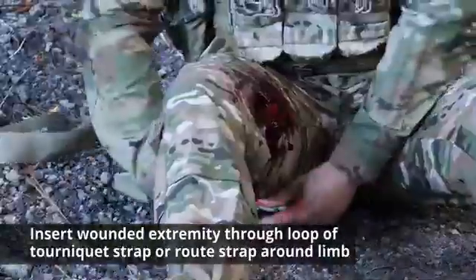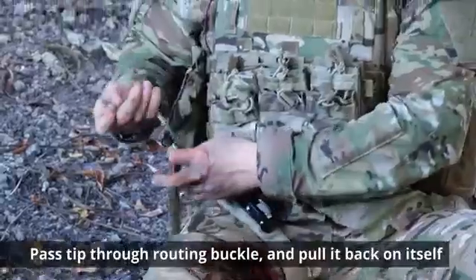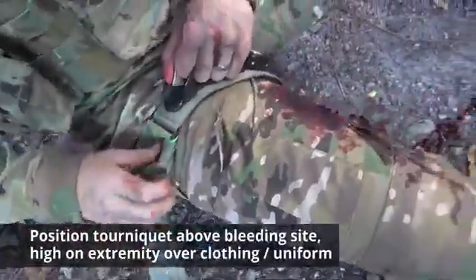Insert the wounded extremity through the loop of the tourniquet strap, or route the strap around the limb. Pass the tip through the routing buckle and pull it back on itself. Position the tourniquet above the bleeding site, high on the extremity over the clothing or uniform.